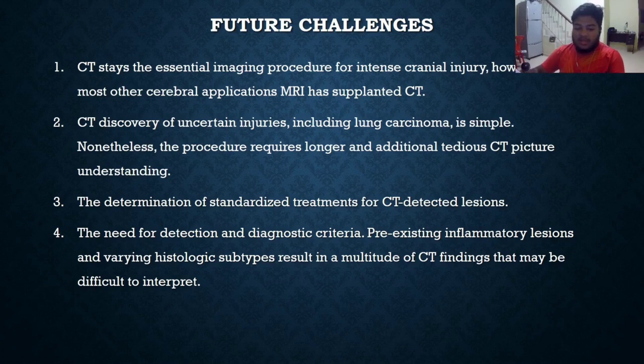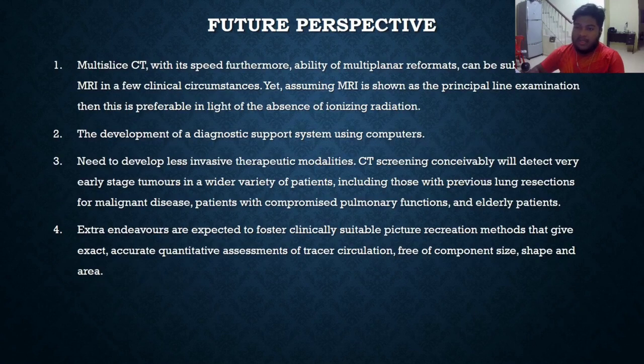Thirdly, is the determination of standardized treatment for CT-detected lesions. And lastly, the need for detection and diagnostic criteria. The pre-existing inflammatory lesions and varying histologic subtypes result in a multitude of CT findings that may be difficult to interpret. Next is question number 8.